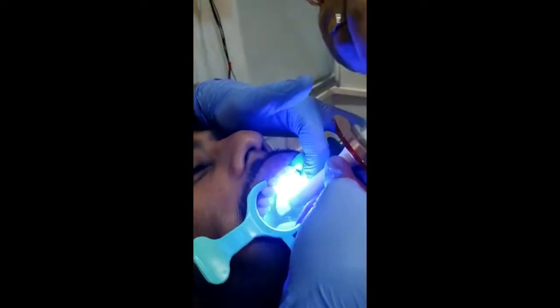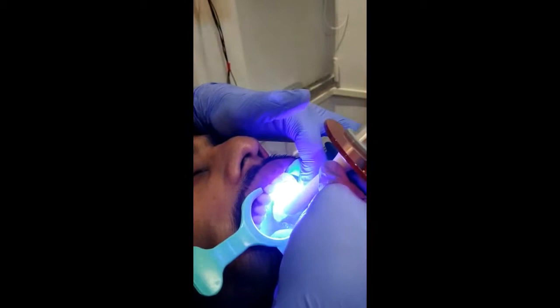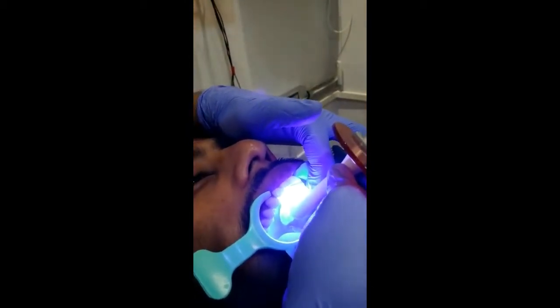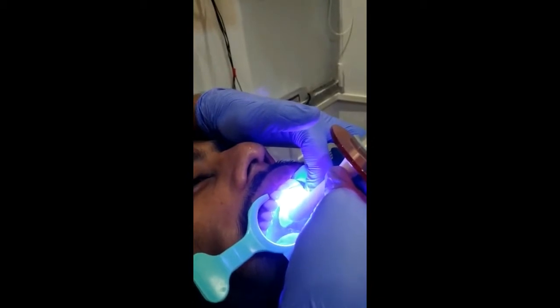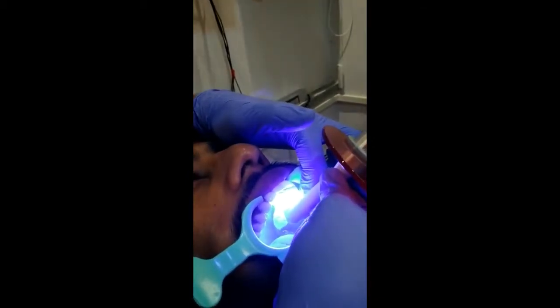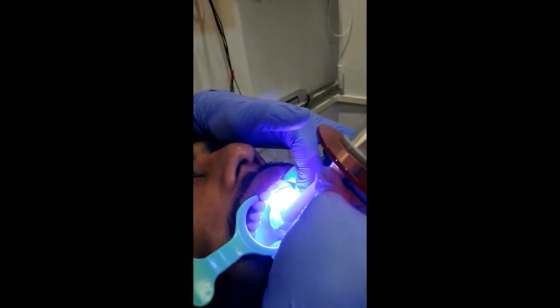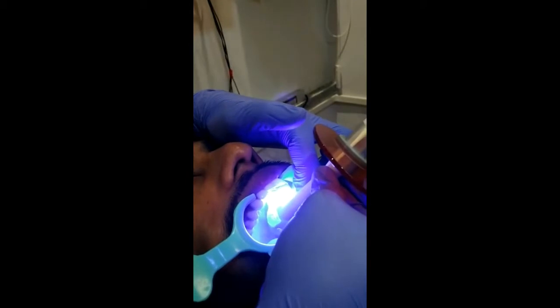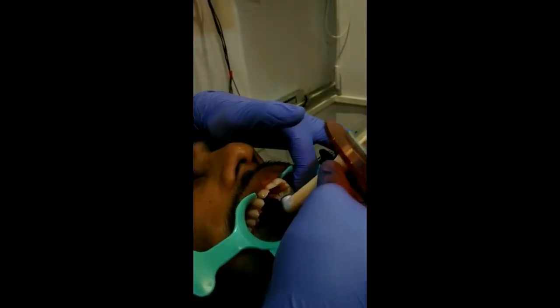And as we are reducing chair side time, we do not have to struggle with isolation for that prolonged period of time. Also, exclusively considering lingual orthodontics, it is very important because we need exact precise bonding of the teeth, as well as because it's a lingual technique, it is very difficult to manipulate the bracket positioning chair side.